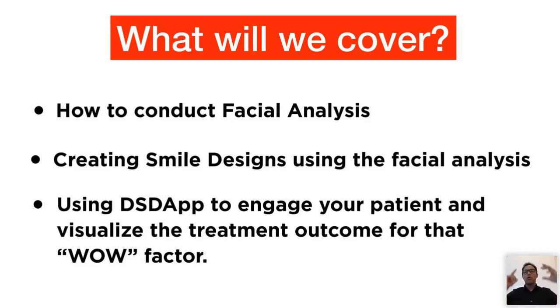Before we get started, I want you to start thinking: when it comes to facial analysis in dentistry, what are the challenges that you are facing right now? The reason I am asking is because we know that the process involves applying mathematical rules, geometrical principles, and straight lines. And we learn all that in our dental school.